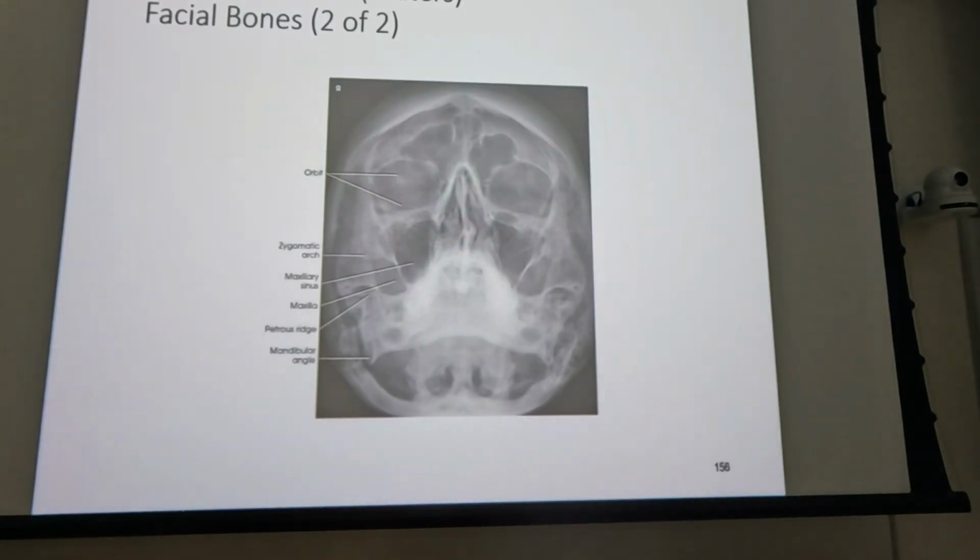and the skull drawing positioning on page 61, what's the difference between those 2? 37 degrees and 55 degrees. Yeah, 37 degrees, 55 degrees, the nose is closer to the image receptor. So your positioning for the 55 Waters is going to be with the nose and the chin on the image receptor. 37-degree Waters, the chin is extended back so that you've got about a finger's width in front of it.